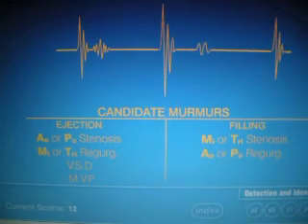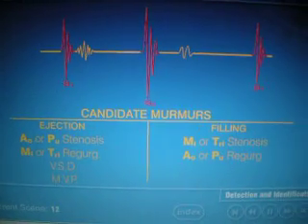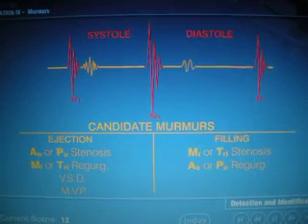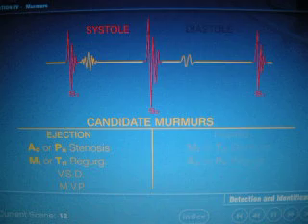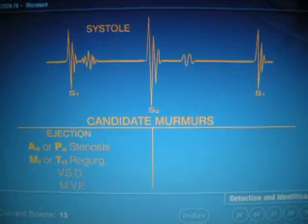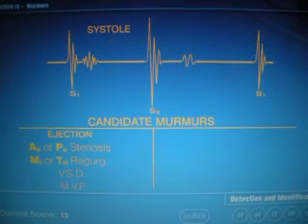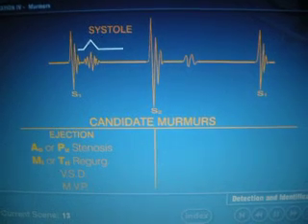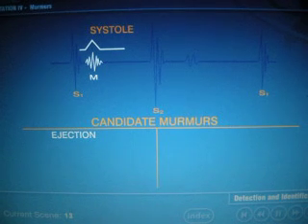Identification of murmurs begins with identification of S1, then S2, and systole and diastole. Correct timing of a murmur as systolic or diastolic eliminates approximately half of the murmur's potential identities. The final step in identification consists of matching the acoustic profile, the variation in loudness and pitch of a murmur, to one of the three remaining signature profiles produced by basic hemodynamic mechanisms known to produce murmurs.